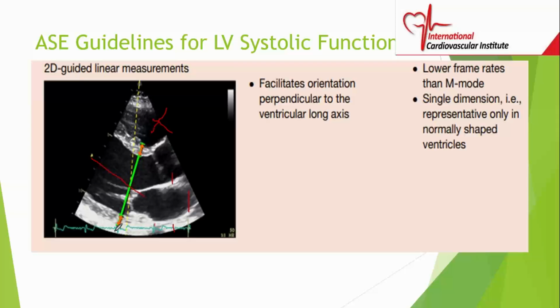You should always have an ECG on your imaging. If you don't have an ECG, however, then you get the largest diameter, that should be diastole, and then the smallest diameter, that should be systole. But you should always try to get an ECG on board.